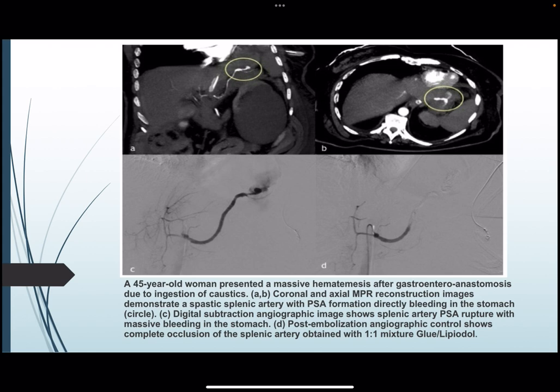A 45-year-old woman presented with massive hematemesis after gastroenteric anastomosis due to ingestion of caustics. Coronal and axial MIP reconstruction images demonstrated a splenic artery pseudoaneurysm with direct bleeding into the stomach. Digital subtraction angiography showed splenic artery rupture with massive bleeding into the stomach. Post-embolization angiographic control showed complete occlusion of the splenic artery obtained with a one-to-one mixture of glue and lipiodol.